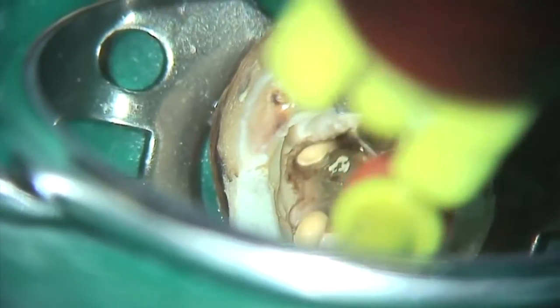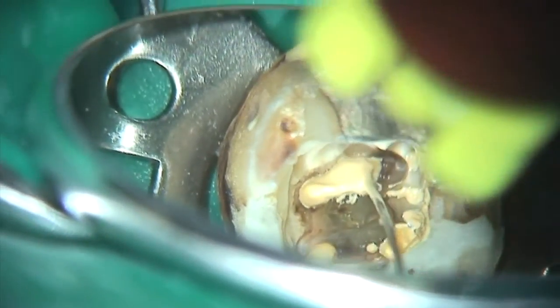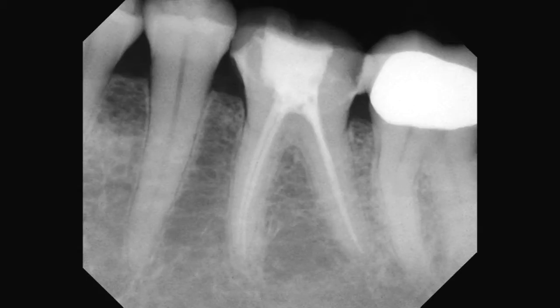I was astounded by it because I had never really experienced that with all the flushing and conventional methods. When I started to utilize the laser and PIPS, I've seen this — it's routine now. If I don't get this, I'm a little bit worried that I haven't got the system cleaned out properly. And notice I don't say root canal; I say system, because it's a system and I want to clean that out totally in three dimensions.